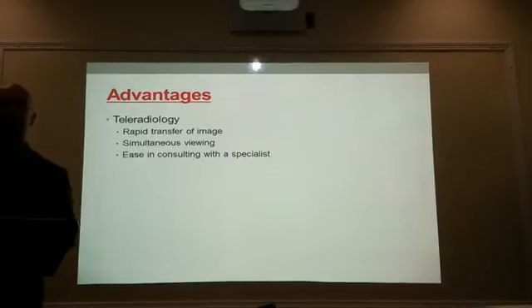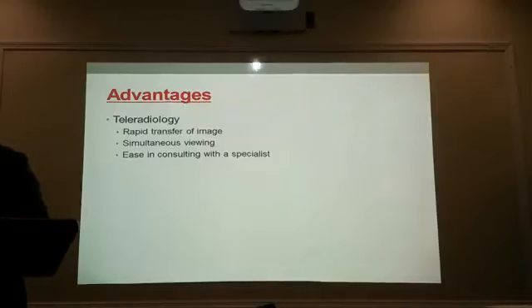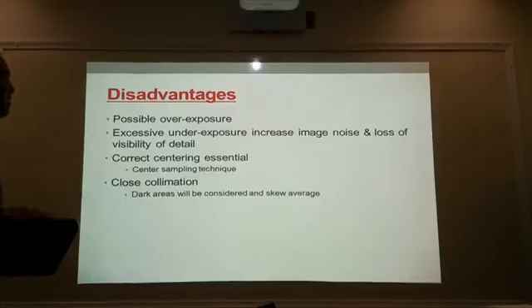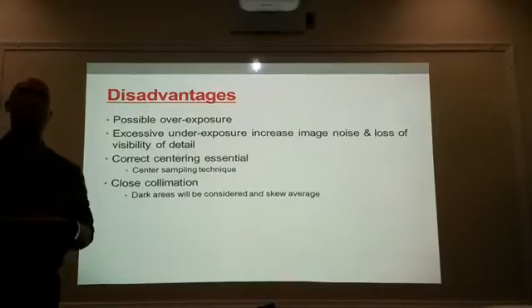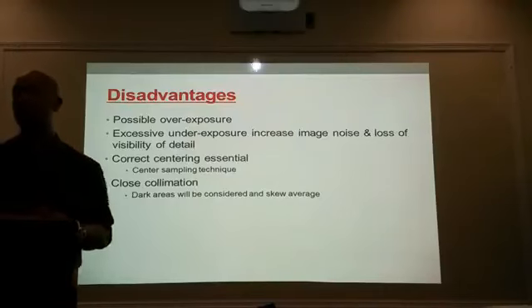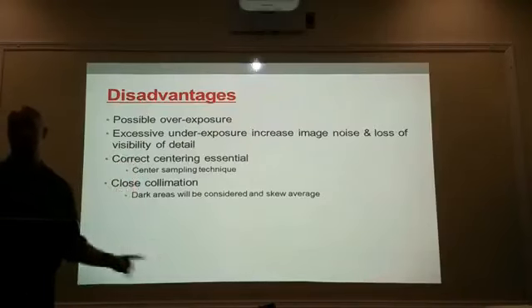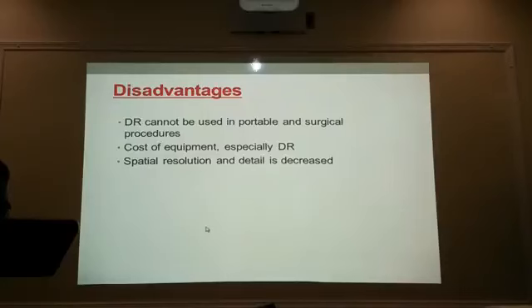And then we talked about teleradiology earlier. Image transfer, image sharing. Okay. The disadvantages is you can have possible over and under exposure because your images look great every time. So we have to reflect on the S and EI numbers. Okay? Skip this, cross that out for now. We'll talk about it when you get into the program. So cross out the last two bullet points. Cross this out. You don't need to know this right now.